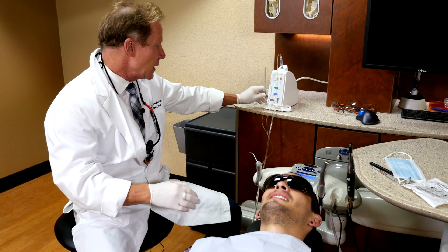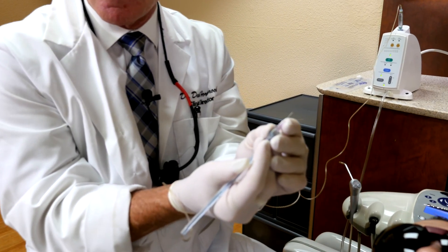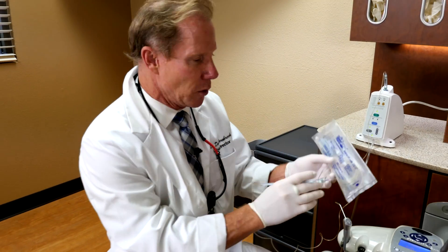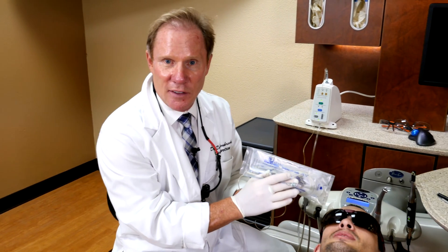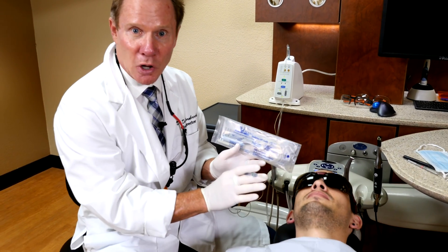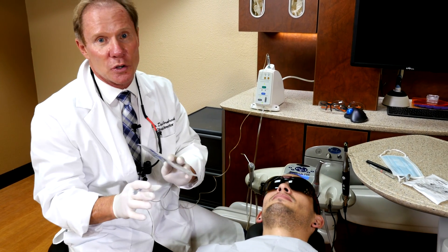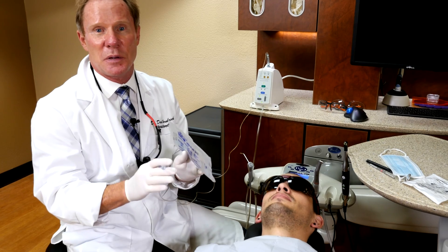This is the STA. It has a very small handpiece. I like to use a 30 gauge short, although it is available in different sizes — this would be a 27 gauge long, which we would use for an IA, an Inferior Alveolar Block. Although, in a moment I'll show you that what we're doing most of the time — 99% of the time — we're giving PDL injections, not blocks.